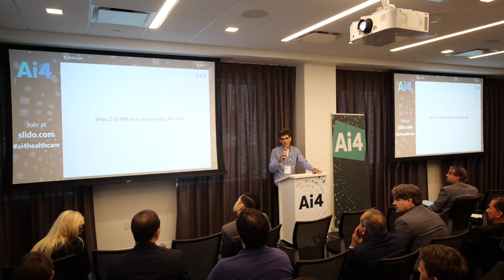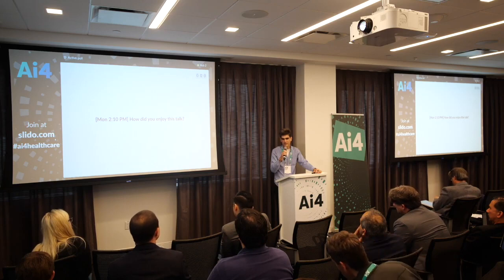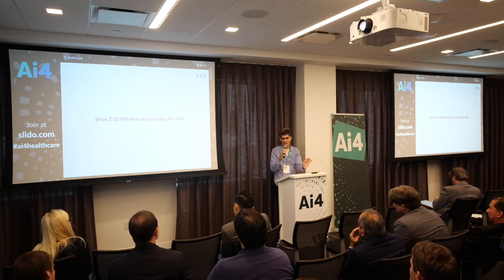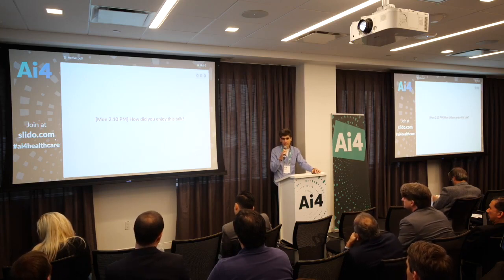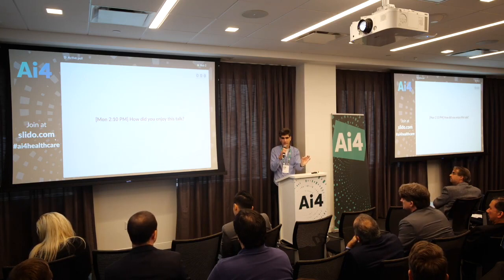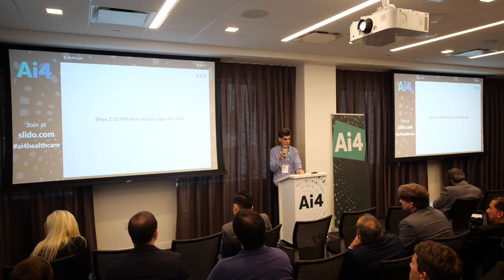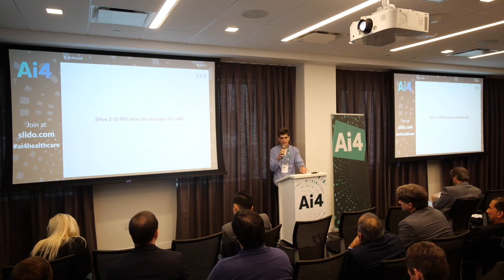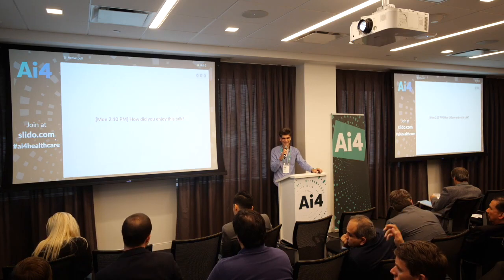Mm-hmm. So sometimes it's helpful to do joint classification and segmentation. You actually want to train the same network to do segmentation of the cells and to do classification. In other cases, you're right, and it's enough to do classification based on a patch. But in some cases, what you find is effective is either to do joint training or to force your classification network to only look at something that's close enough to the nucleus that you have found. Yeah. So it depends.